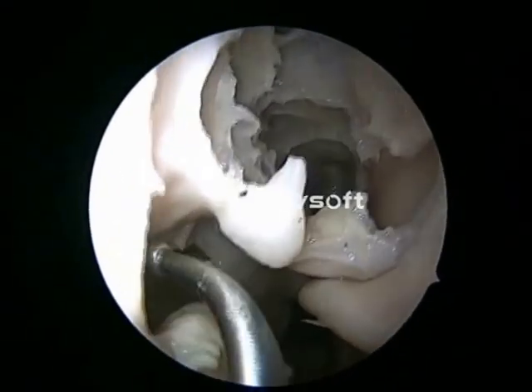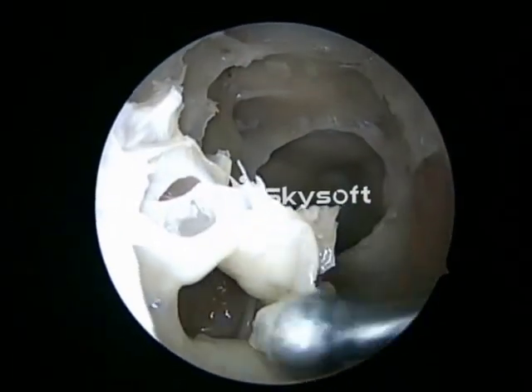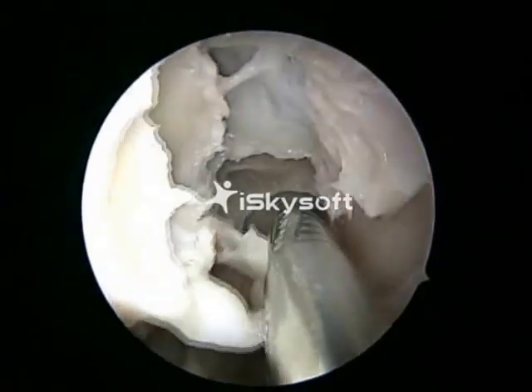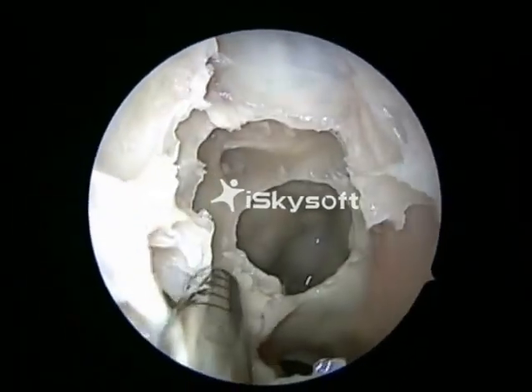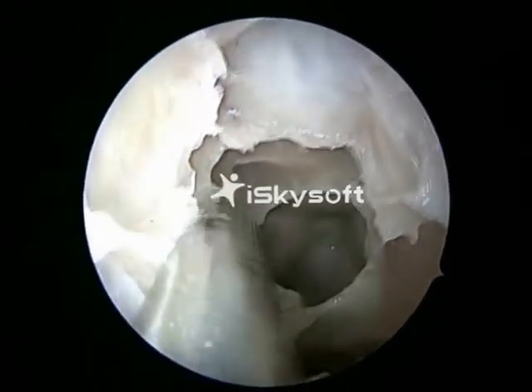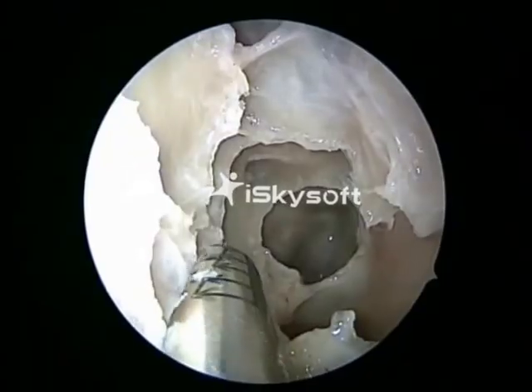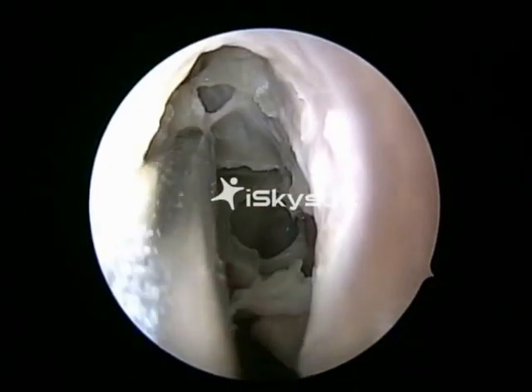Once we go behind the middle meatal antrostomy, in this cadaver, we had a posterior Haller cell. That's a Haller cell. That's a posterior Haller cell, and once we see a Haller cell, we are supposed to connect it with the middle meatal antrostomy. Haller cells can be anterior, middle, or posteriorly placed. They reduce the size of the maxillary ostium.